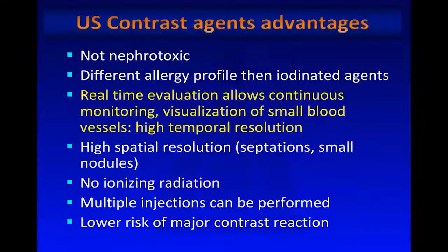The advantage, again, is that they're not nephrotoxic, and they have a different allergy profile than iodinated agents. Their allergy profile is actually excellent, about comparable to gadolinium. A very important advantage is that because you record in real time from the start of contrast administration to minutes within the procedure, you can use continuous monitoring and visualization of small blood vessels from the start of injection to much later on.